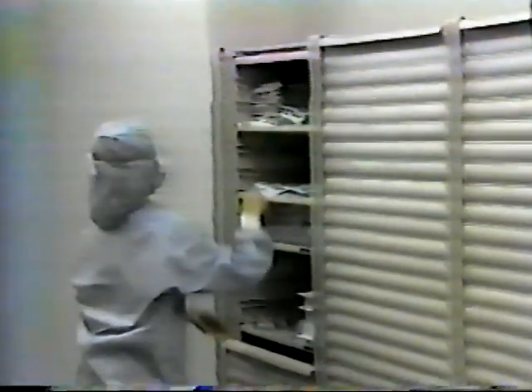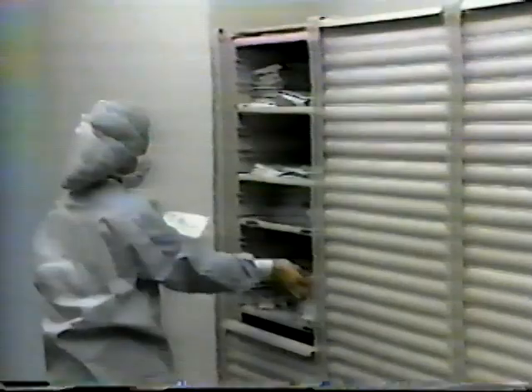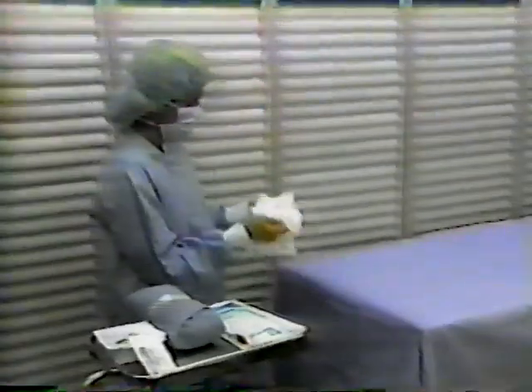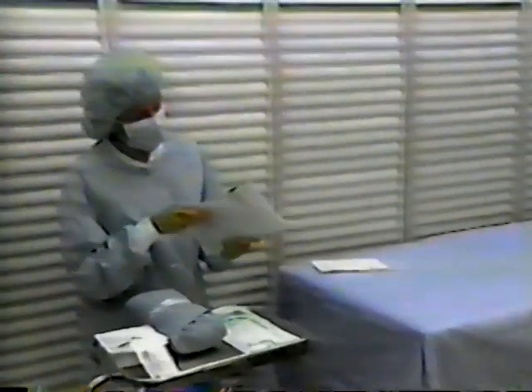The length of effectiveness of package sterility, also called shelf life, is event, not time, related. Storage area conditions, methods of handling, and type of packaging are some variables which determine the length of effectiveness. Each sterile package must be inspected for integrity before being opened to ensure that its contents have not been compromised by holes, punctures, rips, or moisture.